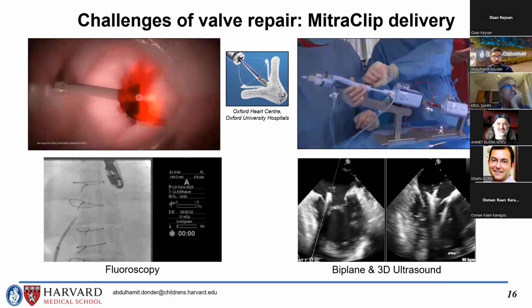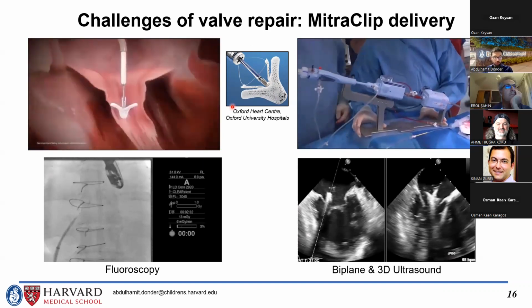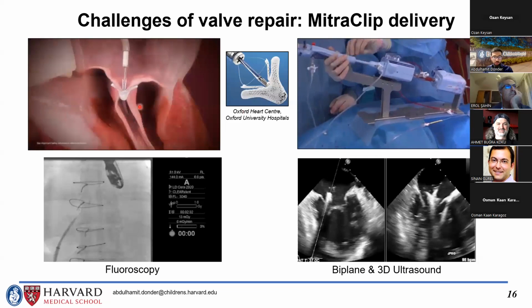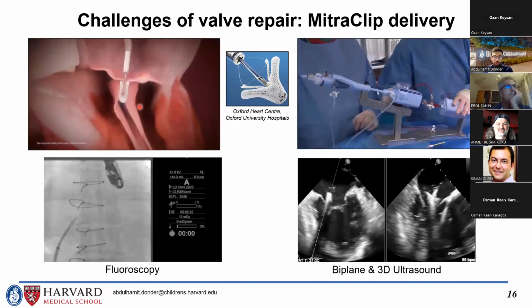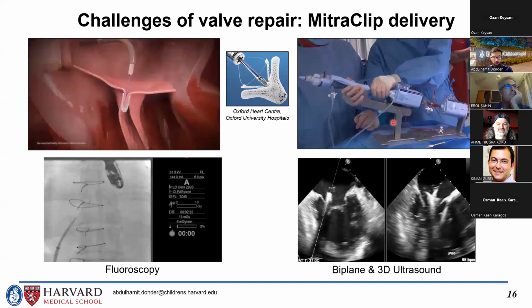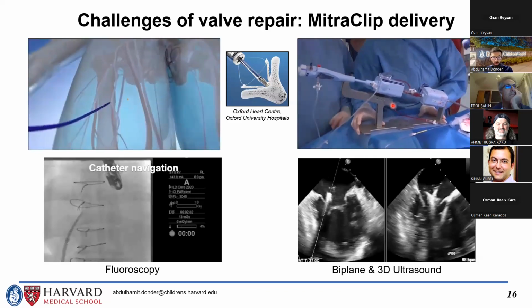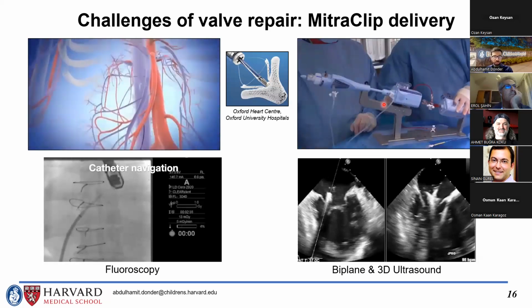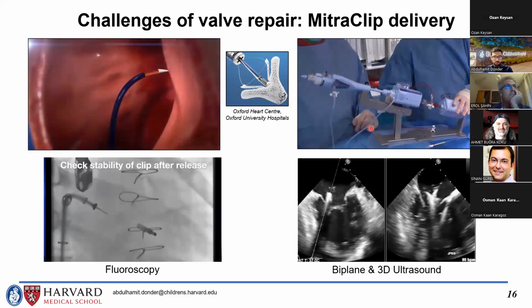One of the home runs of transcatheter valve repair is the MitraClip, as you see here, and it is used to clip together the two leaflets of the mitral valve in order to stop the valve from leaking. It looks easy from the animation shown here, but look at how the shape and position of the catheter are controlled. It involves rotating knobs, rotating segments of the catheter, translating segments of the catheter, as well as sliding the entire catheter handle set back and forth on a plastic sheet.